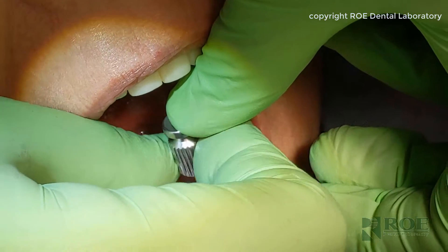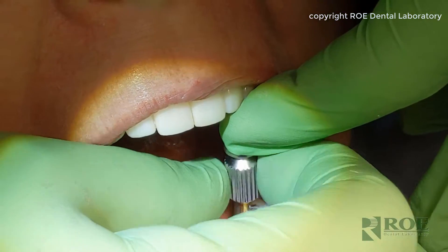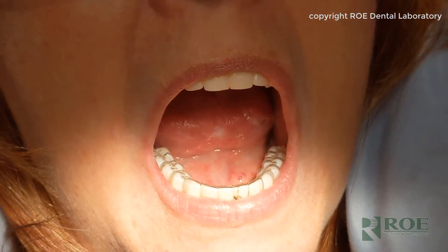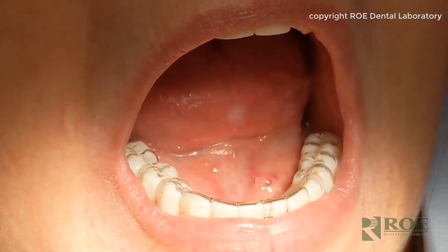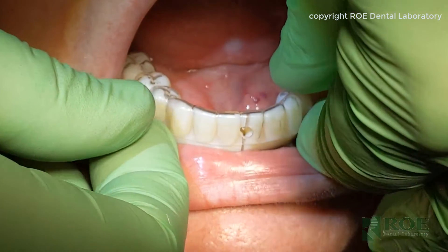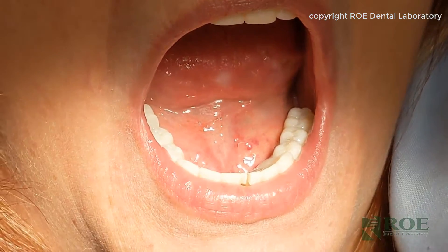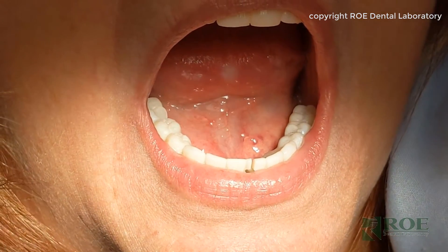All right, the iJIG is in three sections. Screw one section at a time. So all the screws are in. The next step is to remove the delivery suck-down. Then what we want to do is take some dental floss and go in between each section to make sure that they're not contacting.